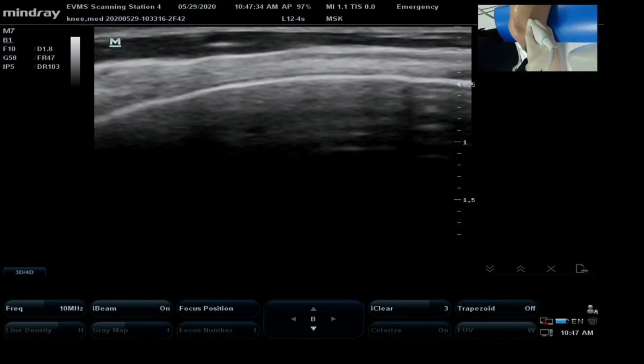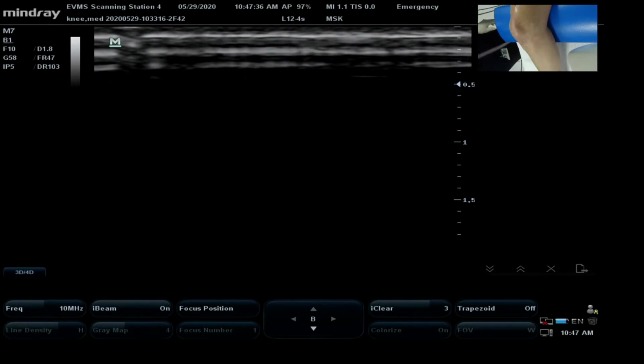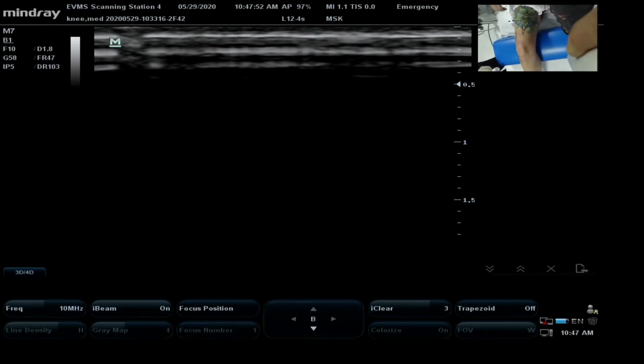Now, finally, on your full evaluation of the knee, we have the popliteal fossa to go through, and that'll be the last thing that I'll show you. Let's see here, I'm going to wipe off some of her knee here so that she can roll over. I'm going to remove the cushion. Go ahead and roll back. Oops, sorry about that.